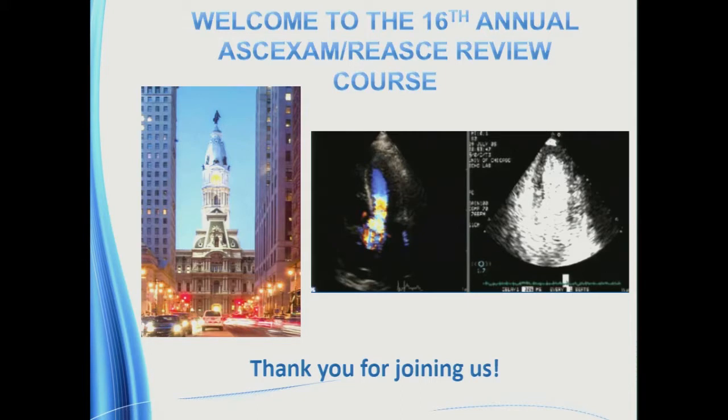Can you assess myocardial viability with strain and strain rate? Good question. The answer to some extent is yes, you can, because you're looking at subtle changes in myocardial motion. There's been a lot of look at myocardial viability using strain and strain rate.